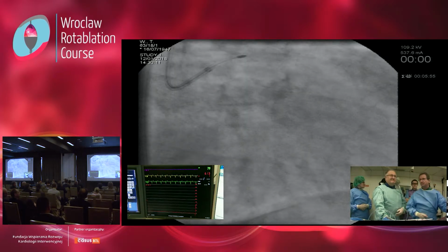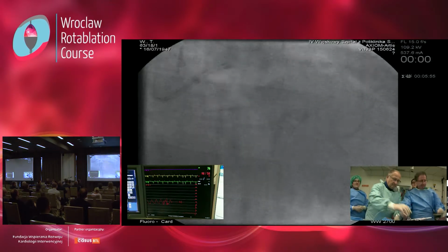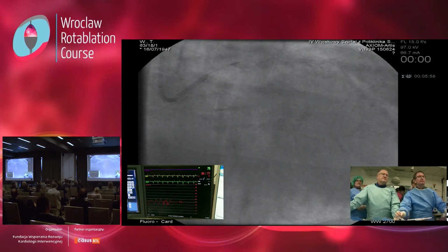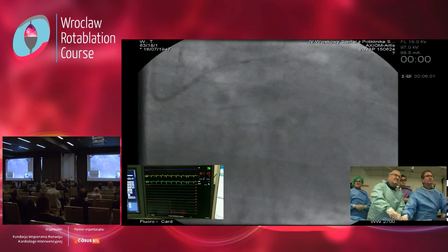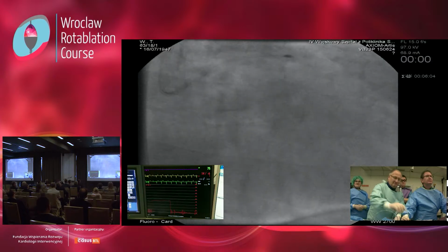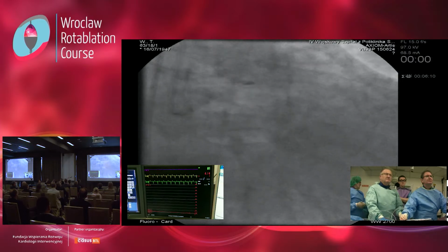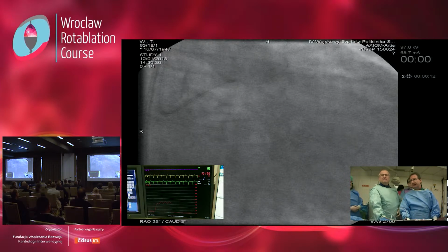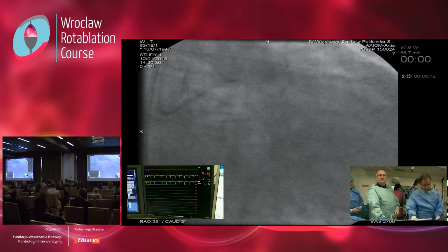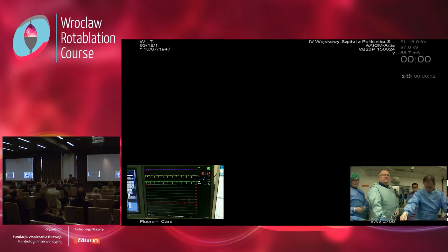It's hard. So we check the flow, patient is stable, ECG is okay. No, still very hard. Patient is, I think, very important topic just to take time. Patient is fine, stable, good pressure, so we go again after a few seconds.